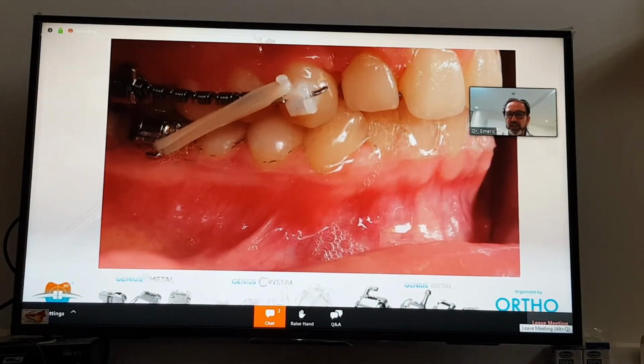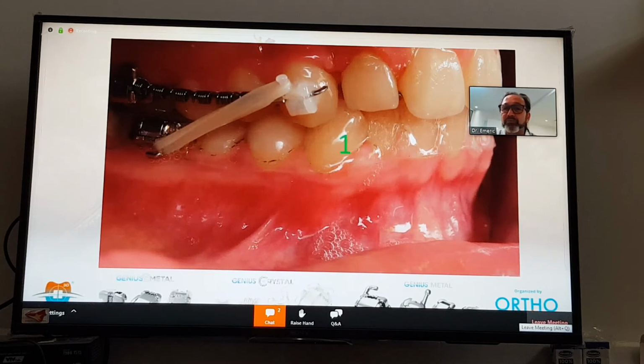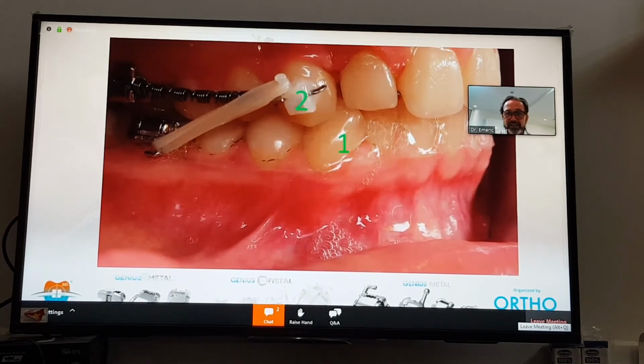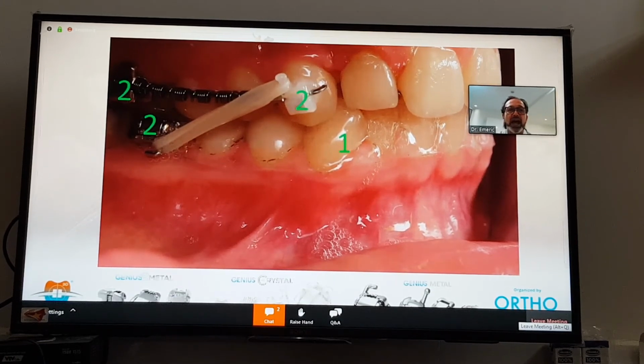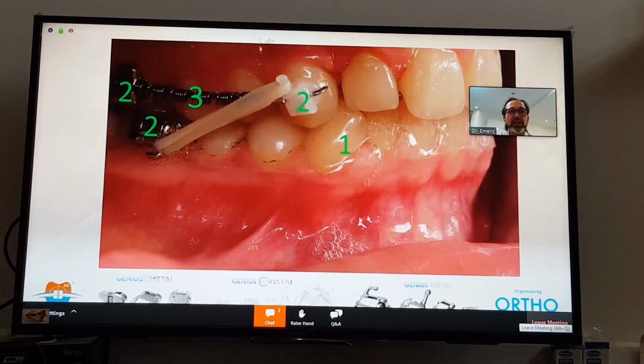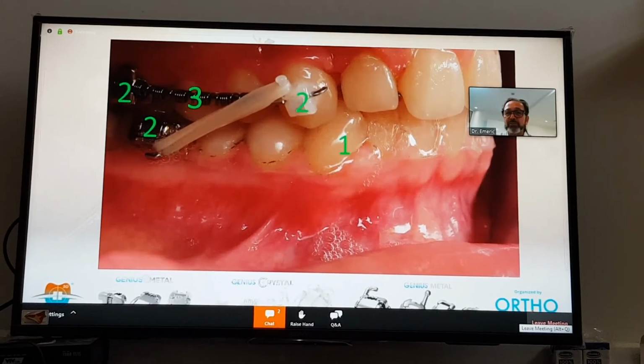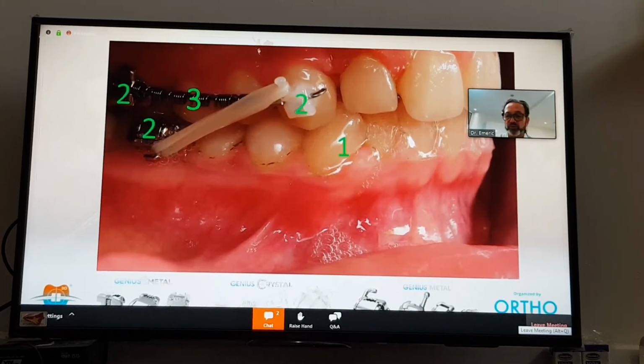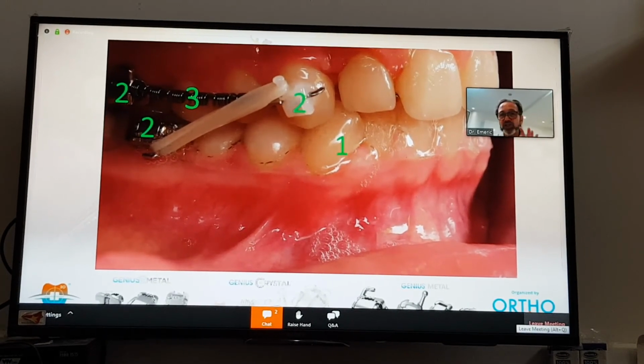so here, now the description of the Sagittal First. First thing, you have to take an impression of your lower teeth. First appointment, you take an impression of the lower teeth. Then, second appointment, you bond the brackets, the Genius bracket on the canine, could be crystal, could be metal, it's the same of course, and the tubes on the molars. We are still in the second appointment. We'll use a segment of wire. I will talk about the segment of wire later with the spring. There is almost no activation of the spring.